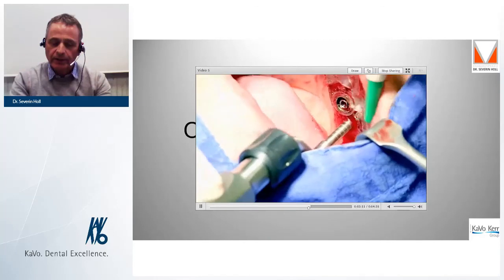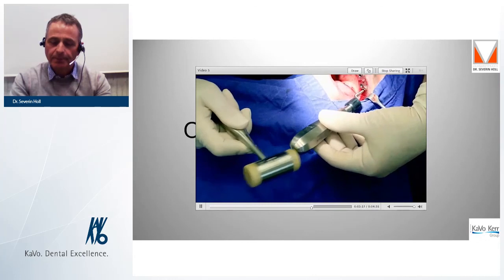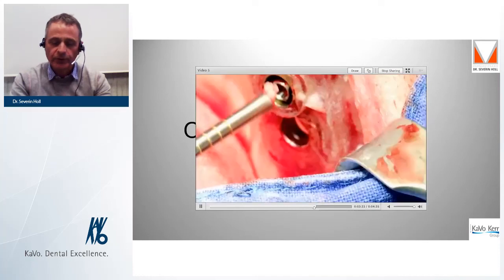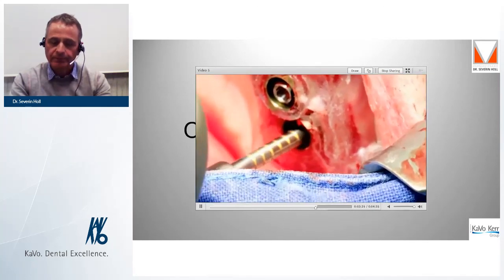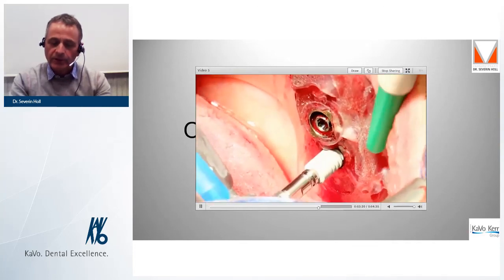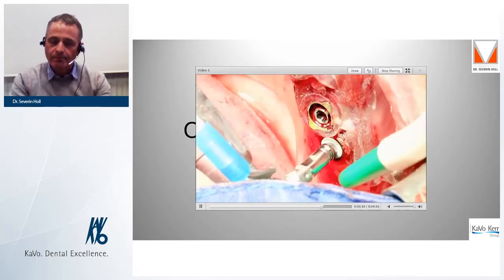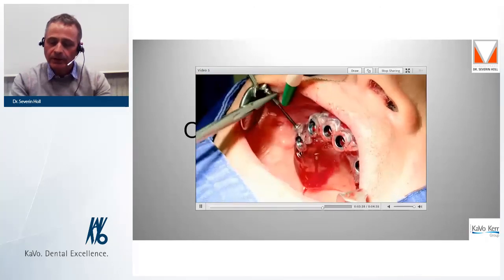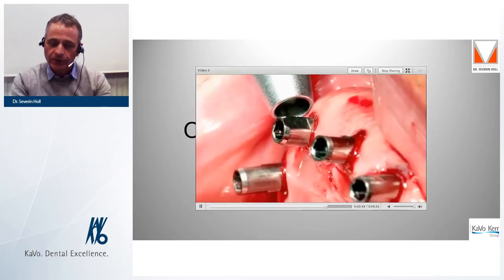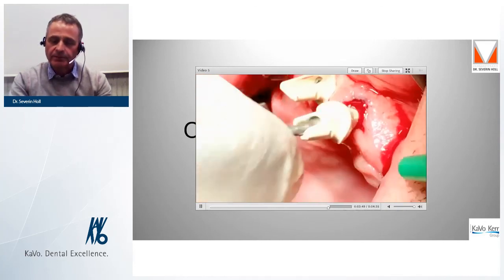We show you once again an internal sinus elevation through the surgical template and the insertion of the collected bone chips. Finally, the mounting of the last implant and we can remove the surgical template. The overall result and the control of the stability with Periotest before starting the prosthetic steps.